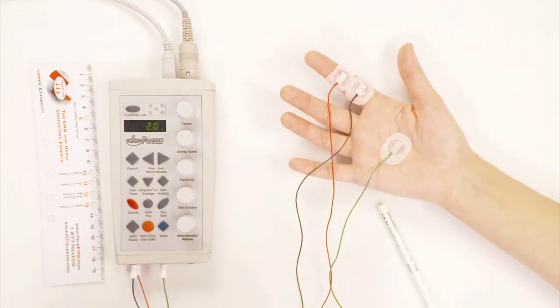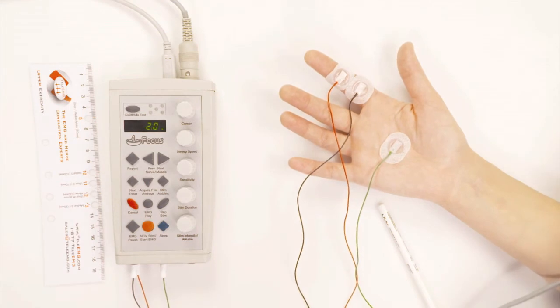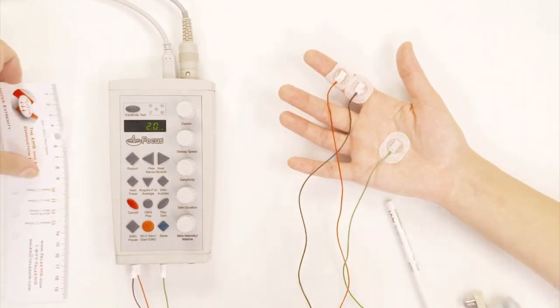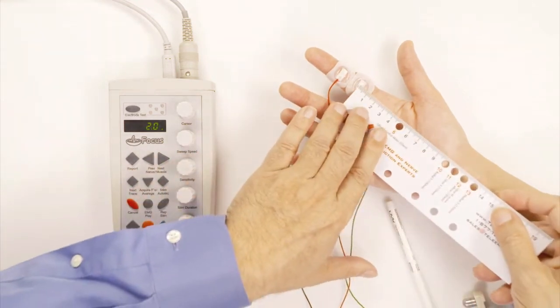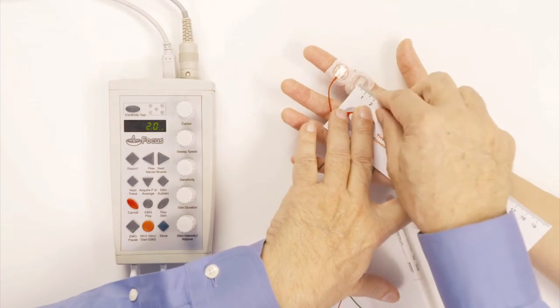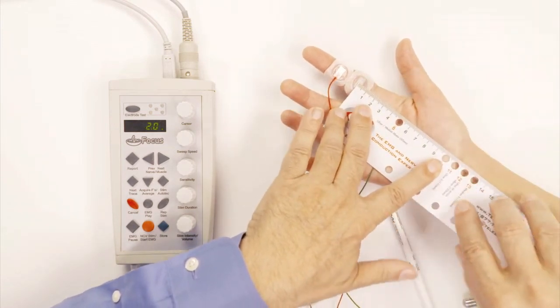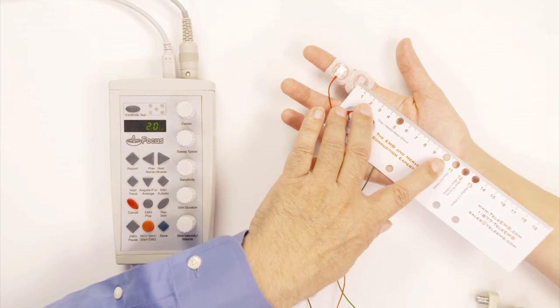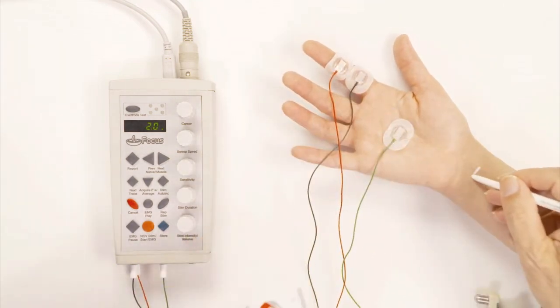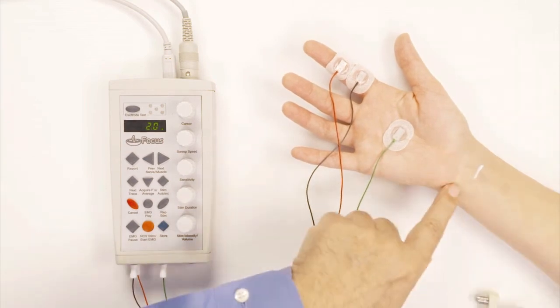So here we go. I put some gel on the stimulator. And then I measure the distance where I'm going to stimulate the nerve. And here I have the zero at the black electrode point. And here it says median sensory. And I will put the marker through this to find out for sure where I'm going to stimulate the nerve. And it turns out to be right here.